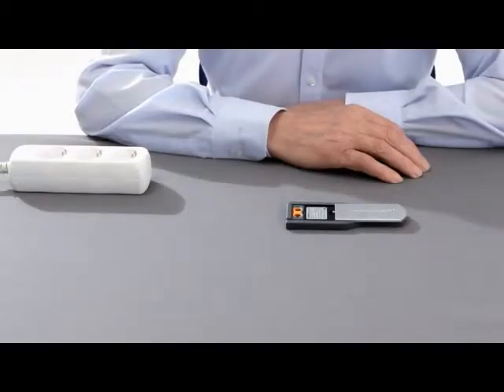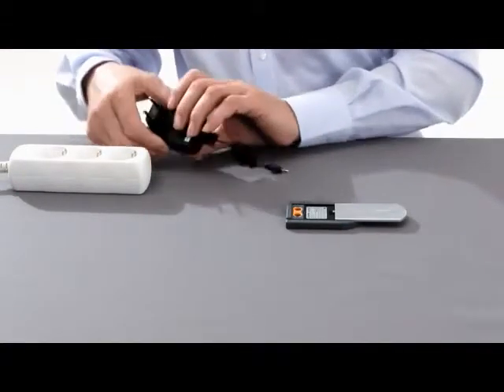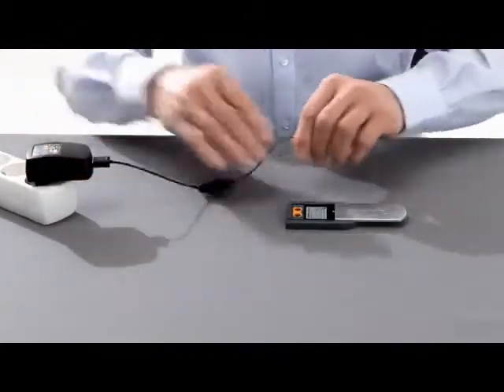The Power One Pocket charger itself is powered by a rechargeable battery. This too needs to be charged once before you attempt to recharge the hearing aid batteries. To do this, connect the pocket charger using the cable supplied to a power outlet and wait approximately five hours.